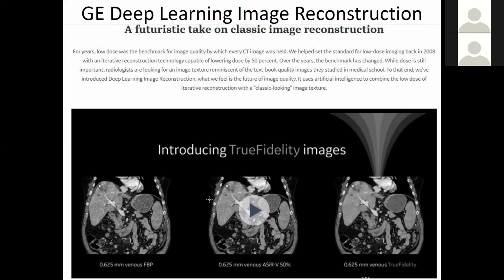So we're on the cusp between, okay, can you measure that you've got quantitatively superior performance from these algorithms? For some cases you can, but the cutting edge is low contrast lesions and what performance you're getting on those. So you need to be careful, but people are careful. And you're starting to get some evidence that beyond just making pleasing images, you're making more accurate images, which are better for the clinical task at hand. So that's your real challenge.